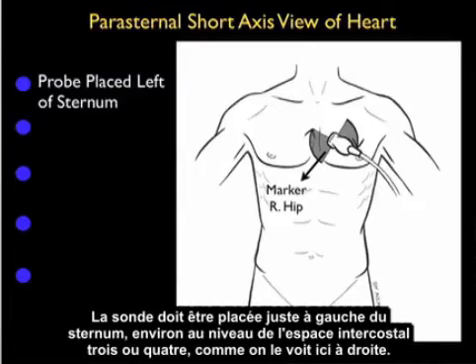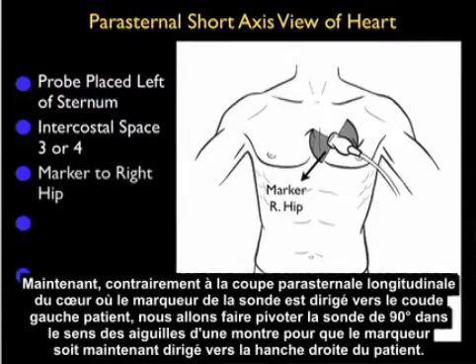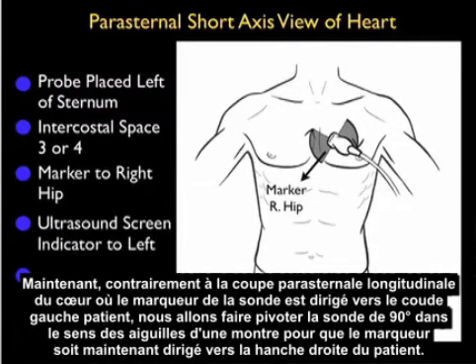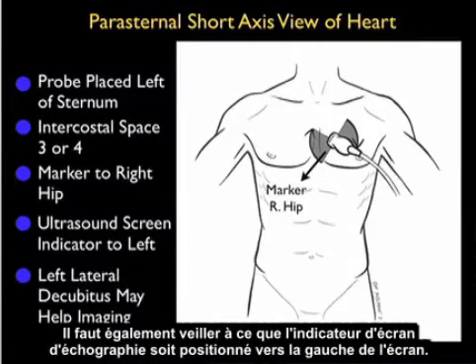The probe will be placed just left of the sternum at about intercostal space 3 or 4 as shown in the pictorial to the right. In contrast to the parasternal long axis view where the probe marker was positioned down towards the patient's left elbow, we'll swivel the probe 90 degrees clockwise so the marker is now down towards the patient's right hip.